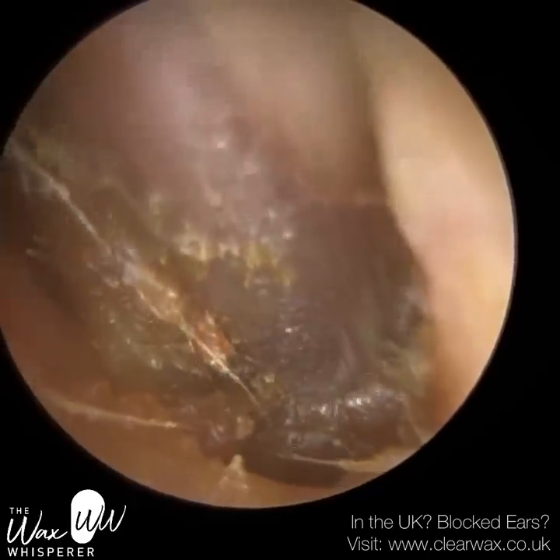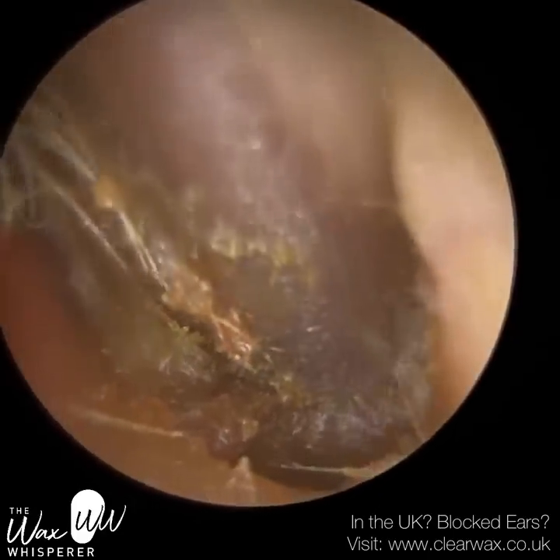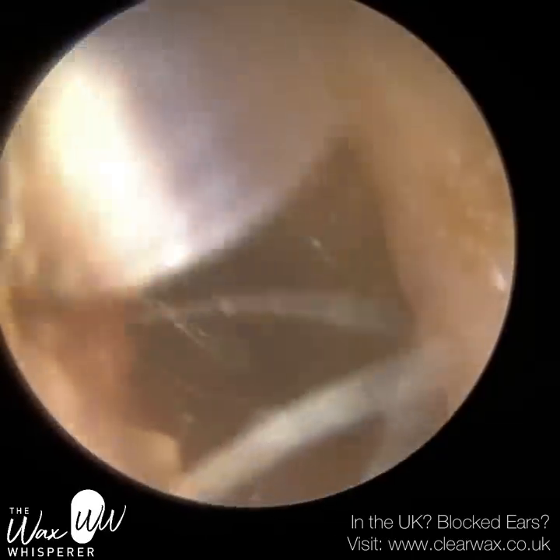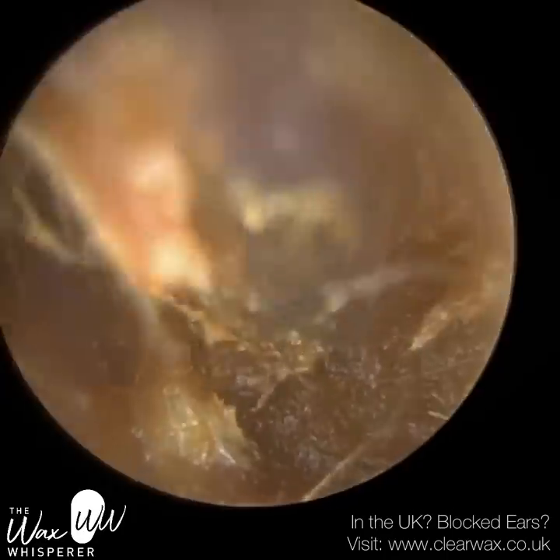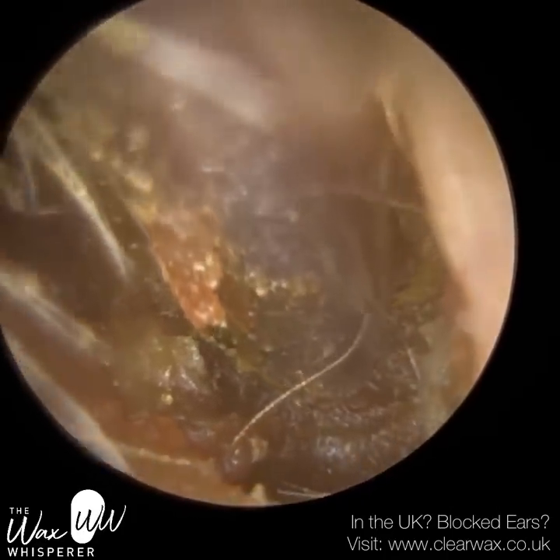They had quite a narrowing of the ear canal as well, in the midsection. Where I am now, you can see on the right-hand side the ear canal wall. The suction probe, which is about 2.1mm in thickness, can just get past that narrowing. Beyond that, as you can see, the ear canal widens and protrudes back out again.